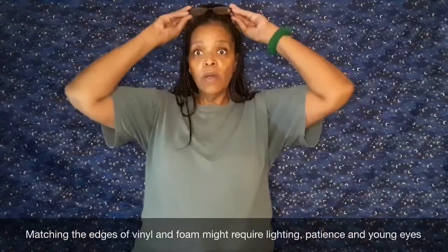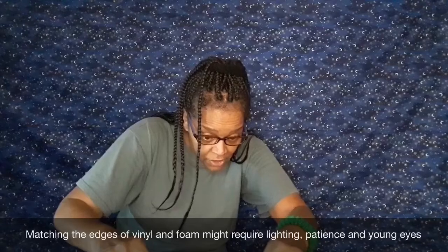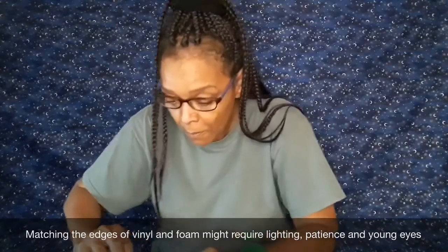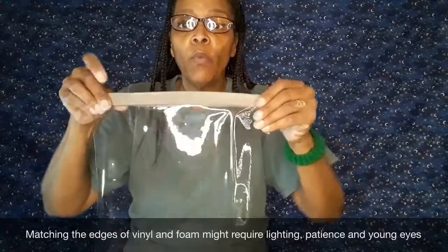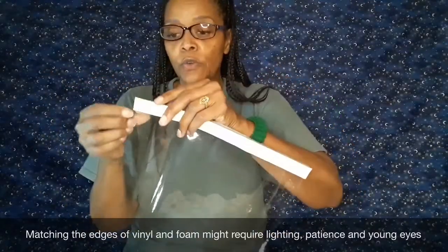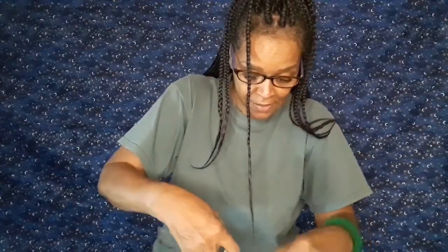And the hardest part of this whole thing is lining up the foam seal on the edge. I'm going to try to do that for you all. Show you. One side of it is adhesive, and the other side that will be next to your forehead is not adhesive. And I can move it a little bit here as I've done. Then I turn it over and usually have to adjust. Okay, so now it is on, and I peel away the part that goes next to the forehead, and it's halfway there.